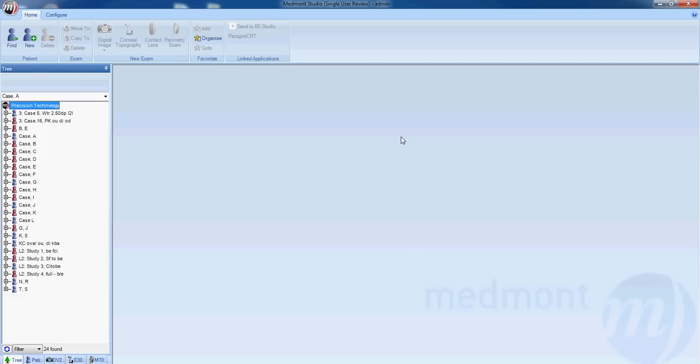This is video 4 on the basic operation with your Medmont E300 corneal topographer.